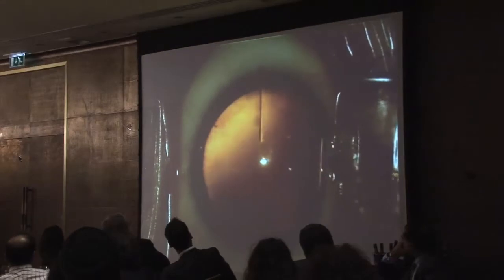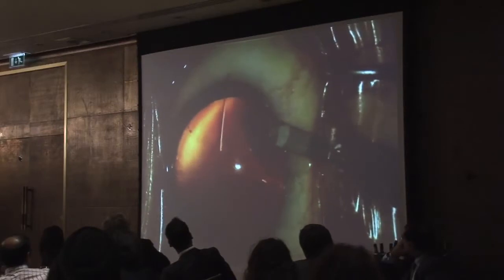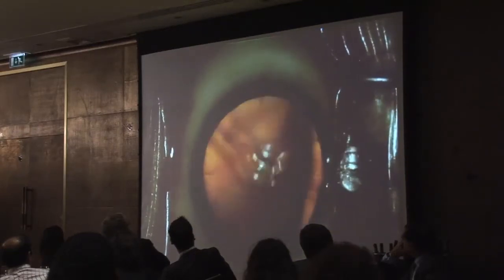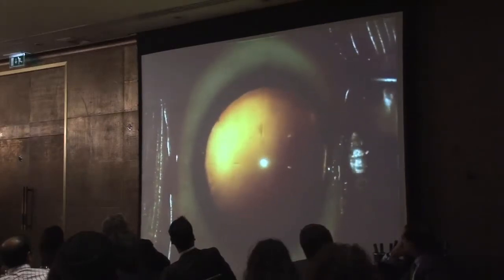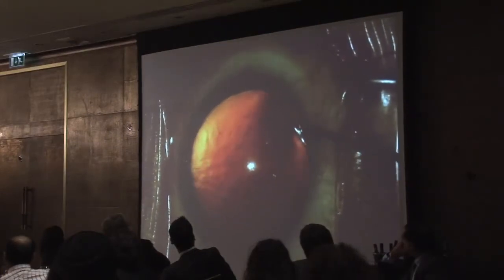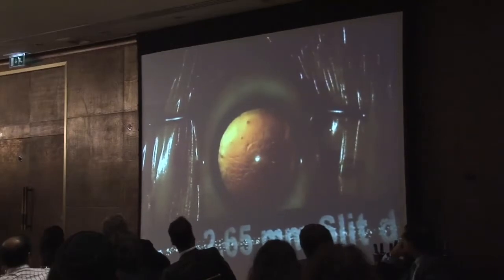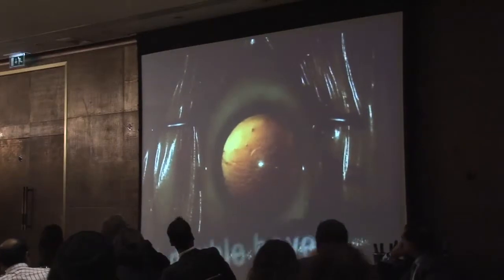To create a watertight 3-step incision, first a 600 micron groove is performed. A single paracentesis is placed nearby the location of the distal haptics. Preservative-free lidocaine is injected into the anterior chamber, followed by methylcellulose. Make sure that the strands of the methylcellulose are still visible, otherwise there is a risk of overfilling the chamber. The main incision is performed with a 2.65 mm double bevel knife.